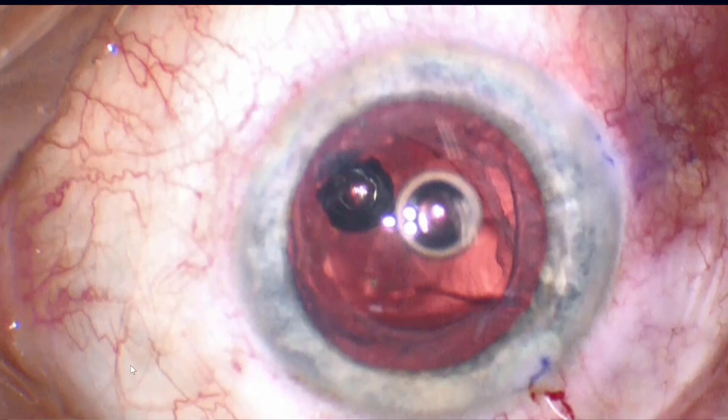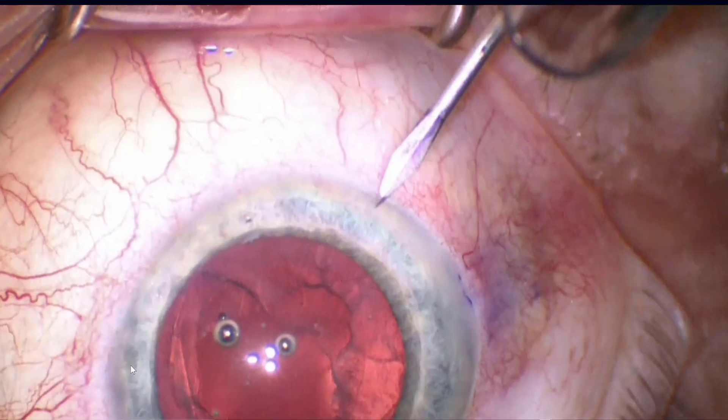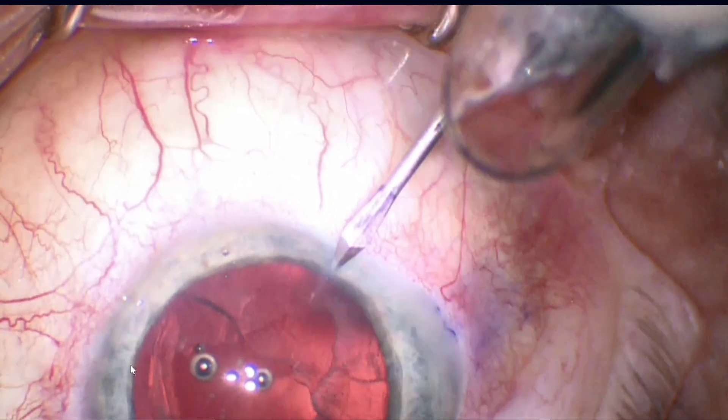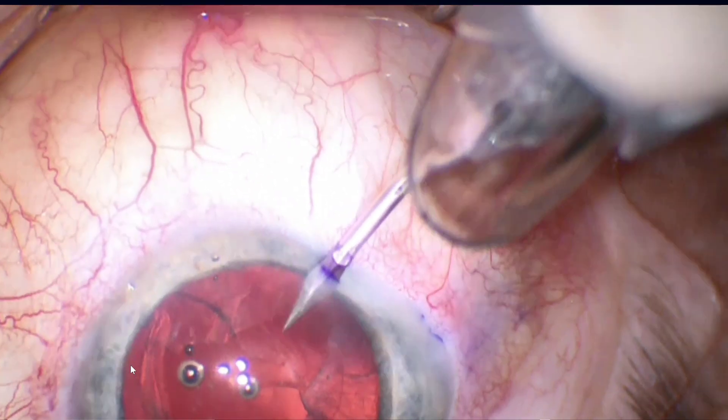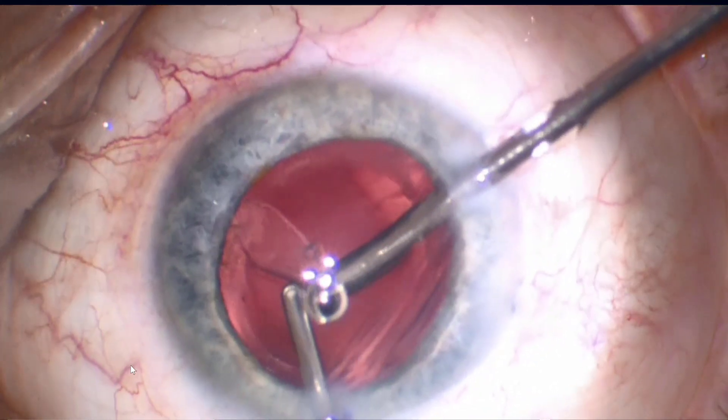Now the question is what do we do next? I think the next step, when we know we're going to do an anterior vitrectomy, is to place another incision so we can have a very tight second incision — not use the main incision, but a second tight incision for the anterior vitrector. In this case we're going to use this MVR style blade, which requires a wider incision than the paracentesis because this particular anterior vitrector is about a millimeter or so wide — a larger gauge. So think of it as a reflex: add dispersive viscoelastic first, then always make a second new port for the anterior vitrector so that you don't use the large main incision.